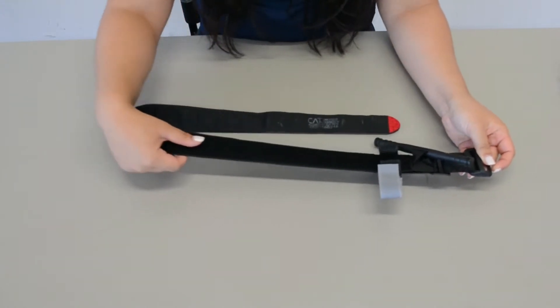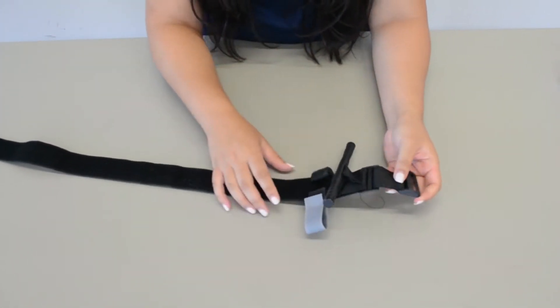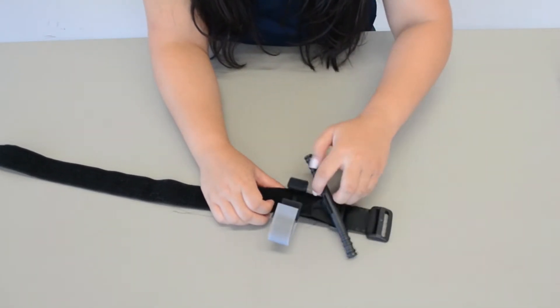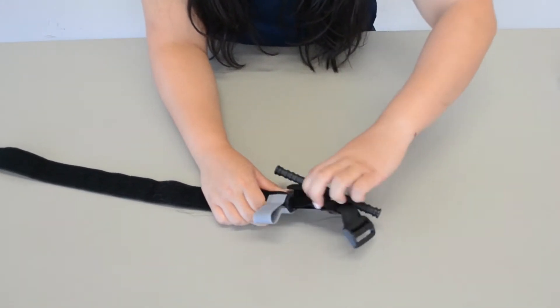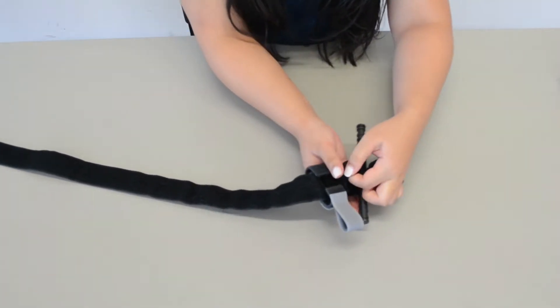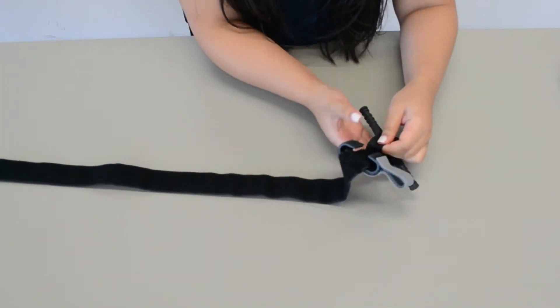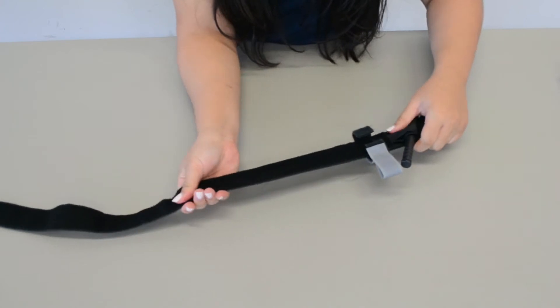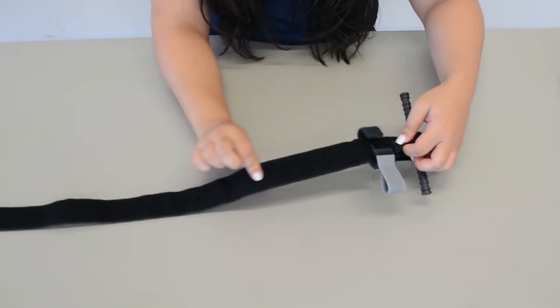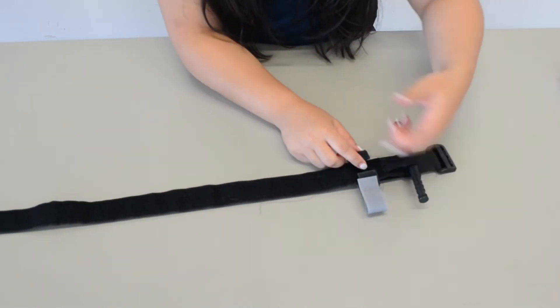So this is going to be how the tourniquet looks unraveled. This component right here is going to be the windlass, so this is where you're going to turn for tightness. The windlass is attached to this piece of string right here, so as you can see as I'm pulling it, the rest of the tourniquet gets tighter. It's very important that we don't cut the tourniquet because the string that's embedded in the body of the tourniquet is just going to unwind.